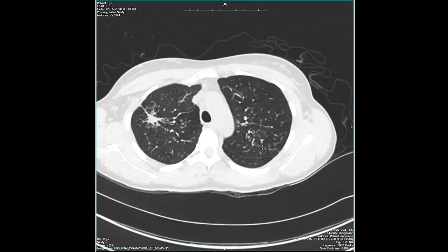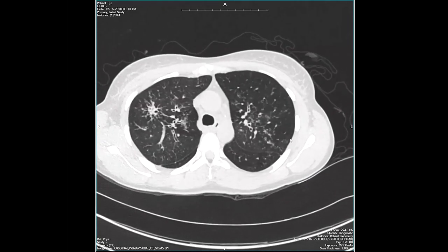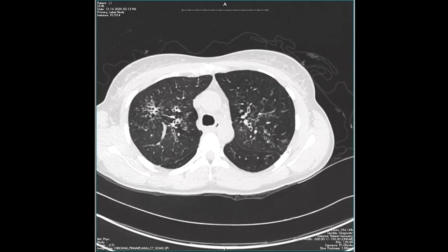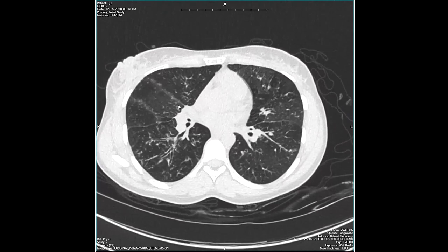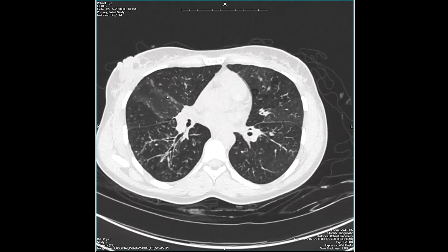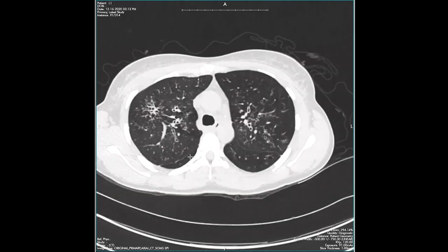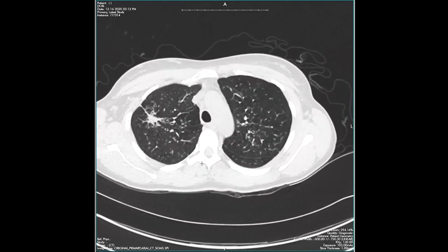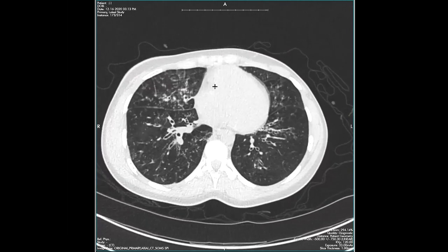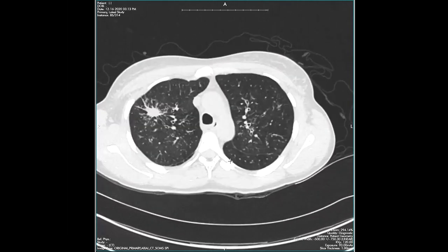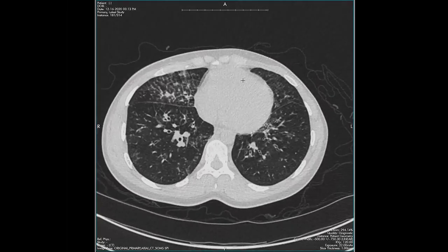This is actually a case of sarcoidosis producing a micronodular lung disease. This case was a little challenging because you'd have been wondering if some of these nodules were related to centrilobular disease like tree-in-bud opacity. But the key features were the studding of the fissural and pleural surfaces and the fact that the nodules were clumped and forming lines within the lung parenchyma. Tying into the history of anterior uveitis — anterior uveitis can be seen as an associated symptom of sarcoidosis.